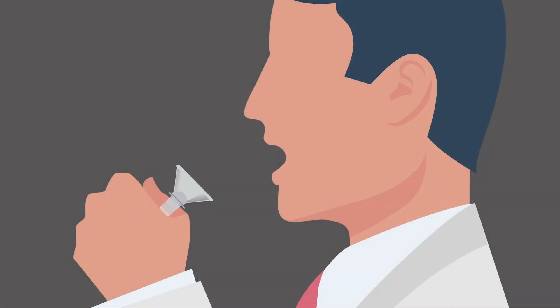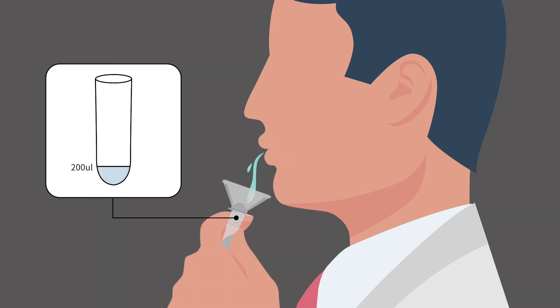Step 5: Gently spit saliva without bubbles into the funnel until it reaches the lower line of the sample collection tube. The patient's mouth should be rinsed with water 30 minutes before sample collection. Do not eat, smoke, or drink after rinsing.